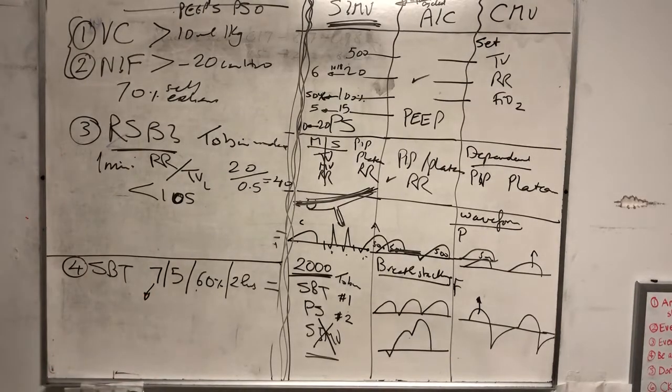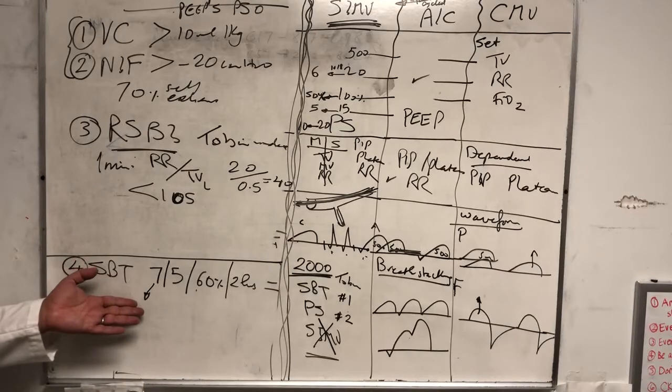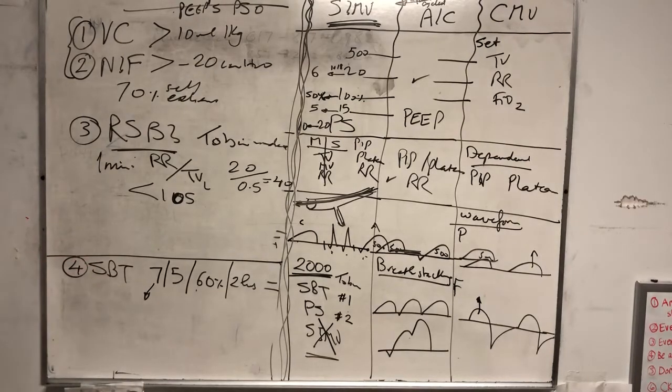Some people get confused, right? And they put the patient on 0/5 because they say we don't want any support. Of course, you're causing more problems. Like you're putting the patient in the negative, right? But I want to give them the benefit of the doubt when they do that.